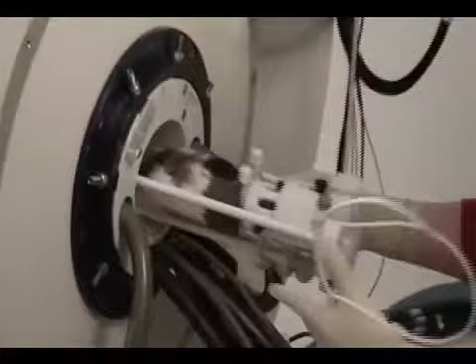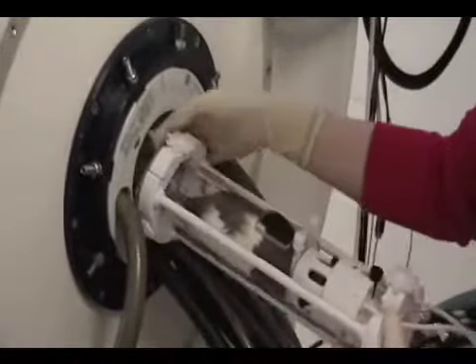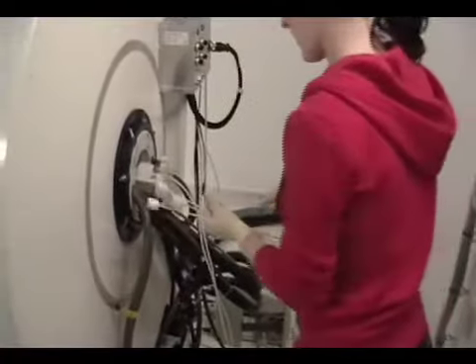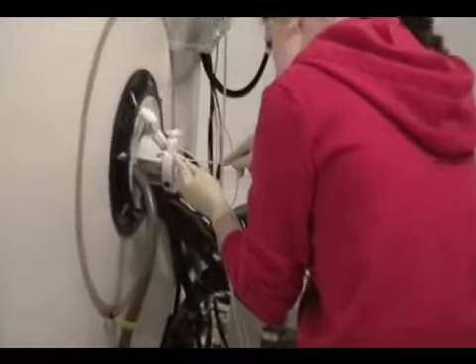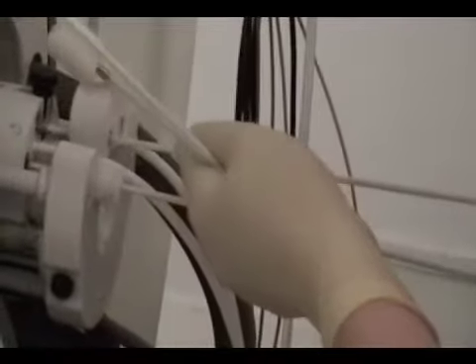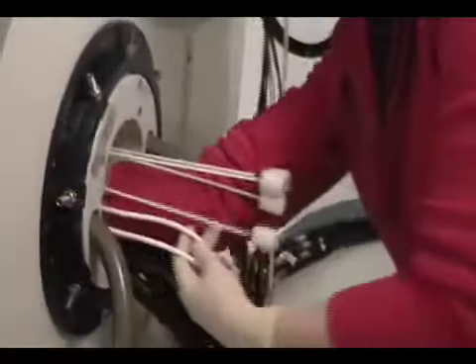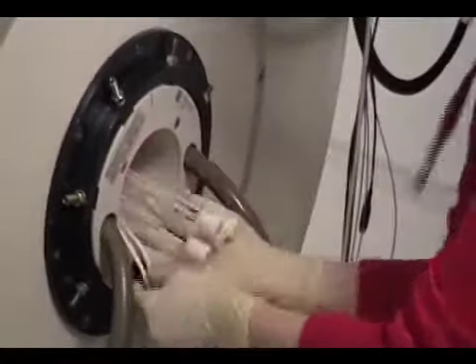The animal is brought into the magnet room and positioned into the bore of the magnet. Tuning and matching rods are placed through the chassis that connect to the quad coil. These rods are removable after the animal has been tuned and matched inside the coil. The quad coil is then positioned to the right location in the bore.